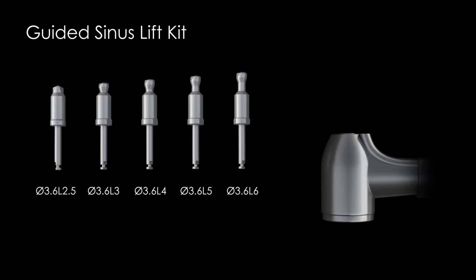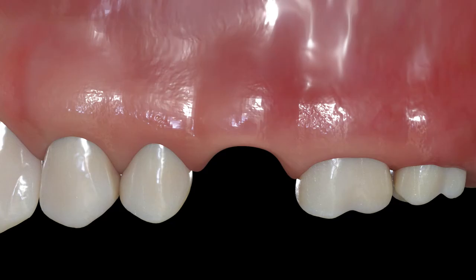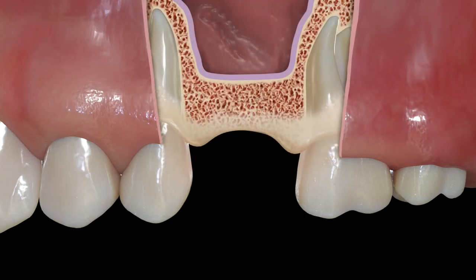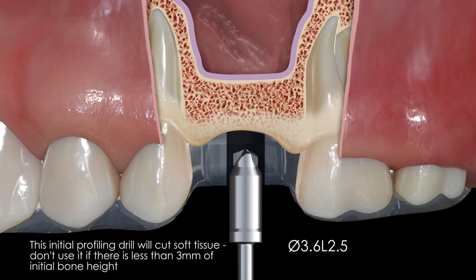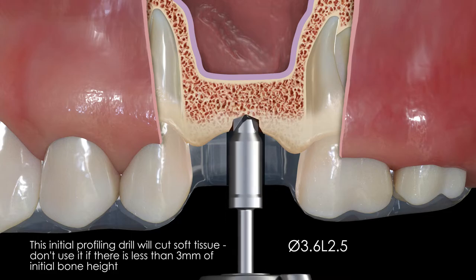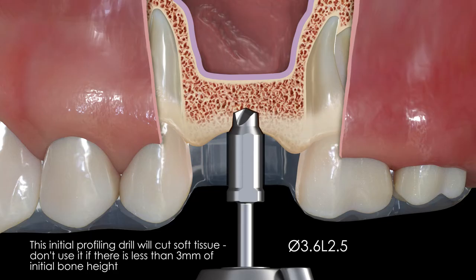Always start with the 3.6 by 2.5 millimeter long starter drill. It should be noted that this is the only drill in the kit that is end cutting and is only intended for profiling the ridge and for creating an initial pilot hole. You should have at least 3 millimeters of initial vertical bone height when using this kit.